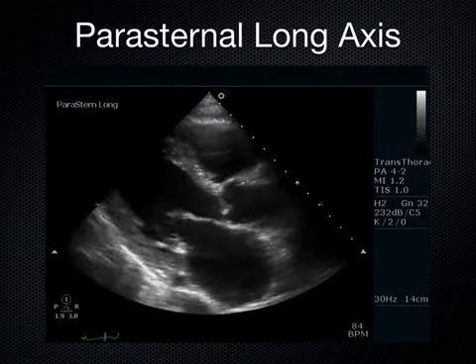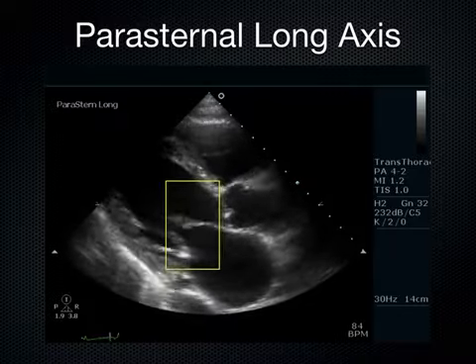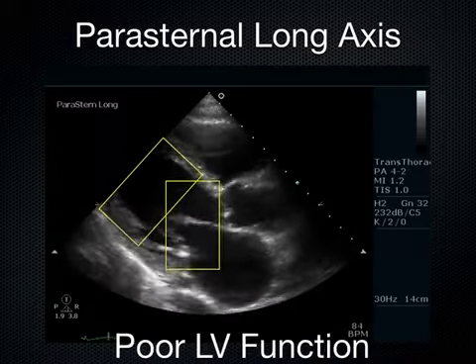Medications or fluids? Medications, exactly right. See that mitral valve there? Not really doing much towards the septum. And we come back there, we look at that septum and that posterior wall, not doing a lot for me either.